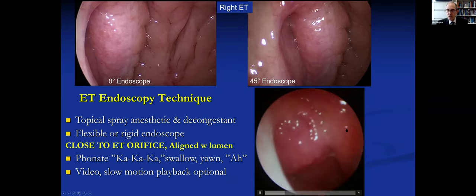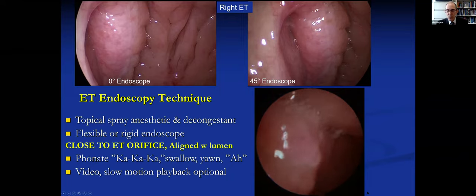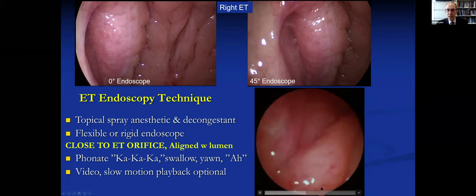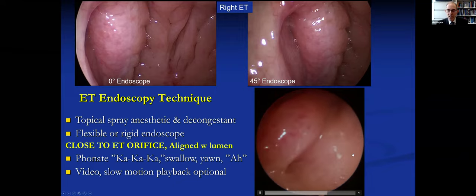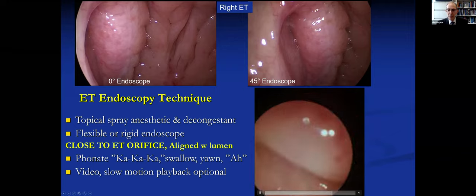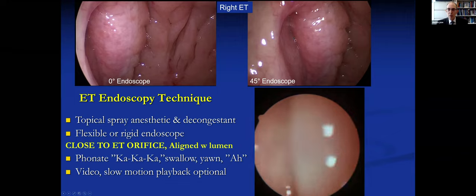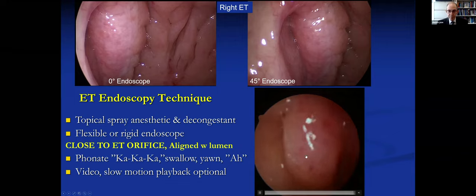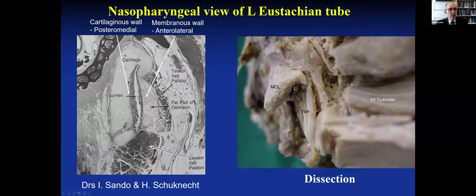Then do a swallow for a normal physiological open, and a yawn for a wide maximal effort. Sometimes people do better with a yawn versus an 'ah.' This is what that looks like with a fiberoptic — left nasal cavity, left torus, adenoid. To see the eustachian tube, we turn the scope 90 degrees so we can flex it across the vomer, looking past the vomer to the right torus. Turn the scope to bring the picture upright, and now we've got the same view as a 45-degree endoscope through the right nostril.